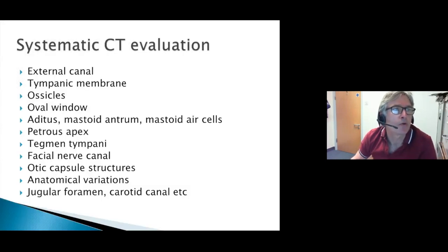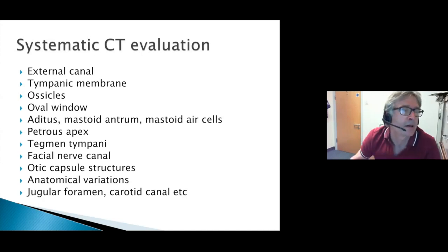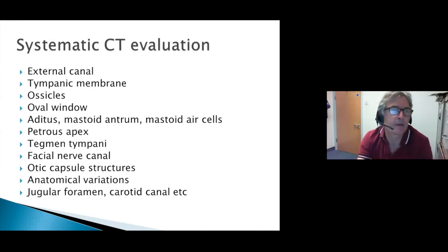Okay, so the title of the lecture has "systematic" in it, and I'd have to say that systematic doesn't really come very naturally to me. I think some radiologists are naturally systematic, and others like me struggle at it. But this is a really good area to be systematic in, because some things will always leap out at us and we can recognize them immediately, but there'll be others where you actually need to go looking in order to see an abnormality. And I think the petrous bone is one area where that holds sway.